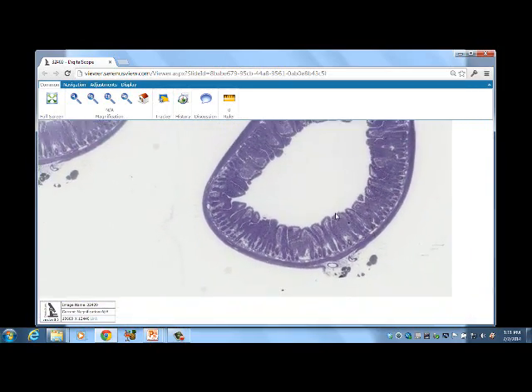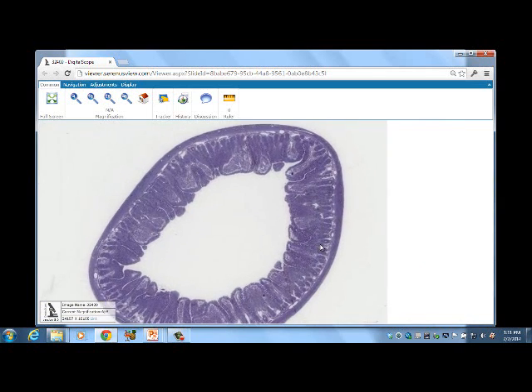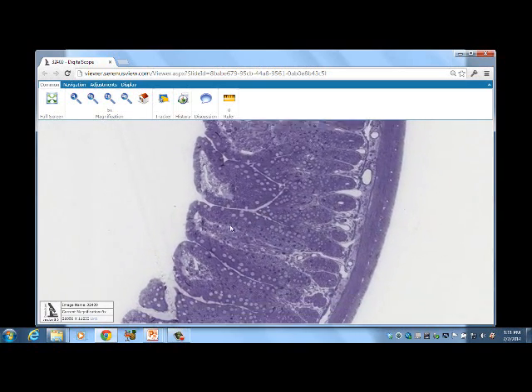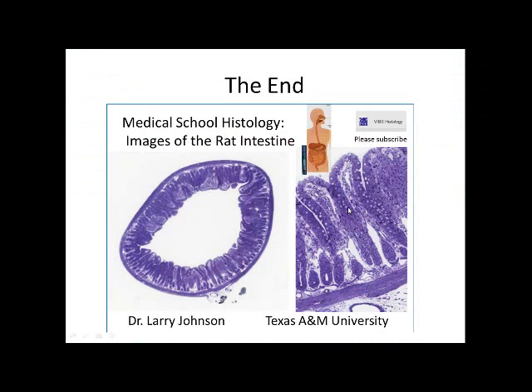in the gut. So remember the different layers. You got the smooth muscle on the outside. You got the mucosa. So the mucosa is from the lumen to the muscularis mucosa. That's mucosa. This is the submucosa, muscularis externa. And then remember the very outer layer is a mesothelium that's located out there too. It's slick and slimy, so the guts can kind of move along. So that's what we will see in our images.